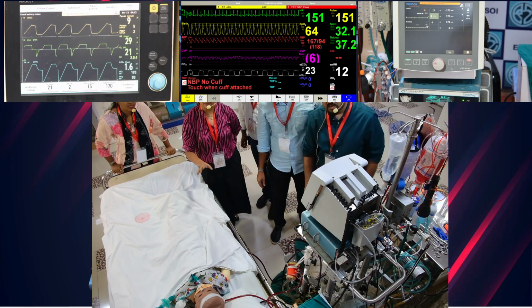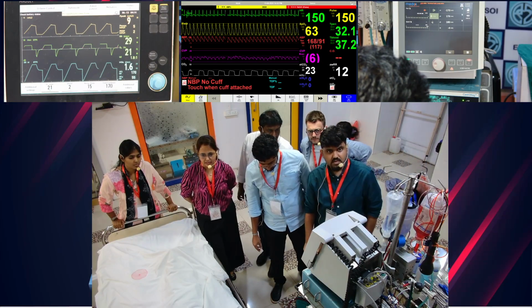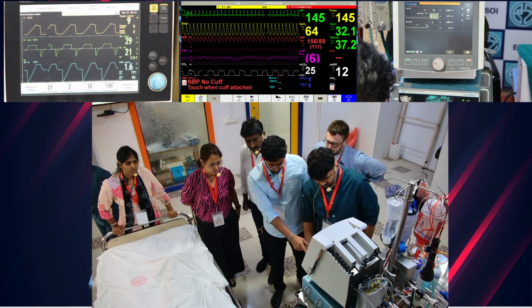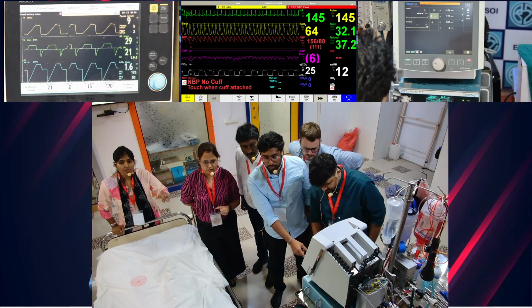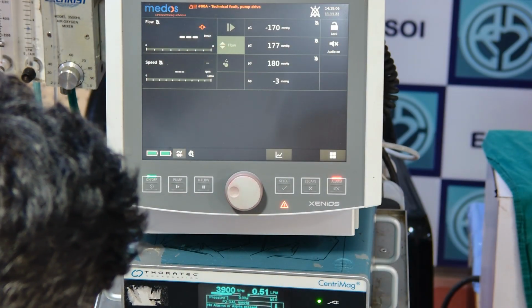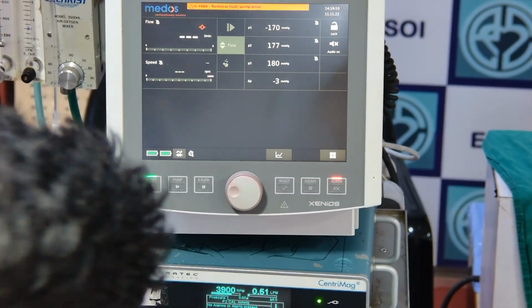First, I would like to address the problem immediately and then start thinking about why the patient is desaturating. So I would like to increase the flow of ECMO. How much is the flow? The flow has actually come down to 0.5 liters. I'll increase the RPM. What are the pressures? The delta pressure has also changed.